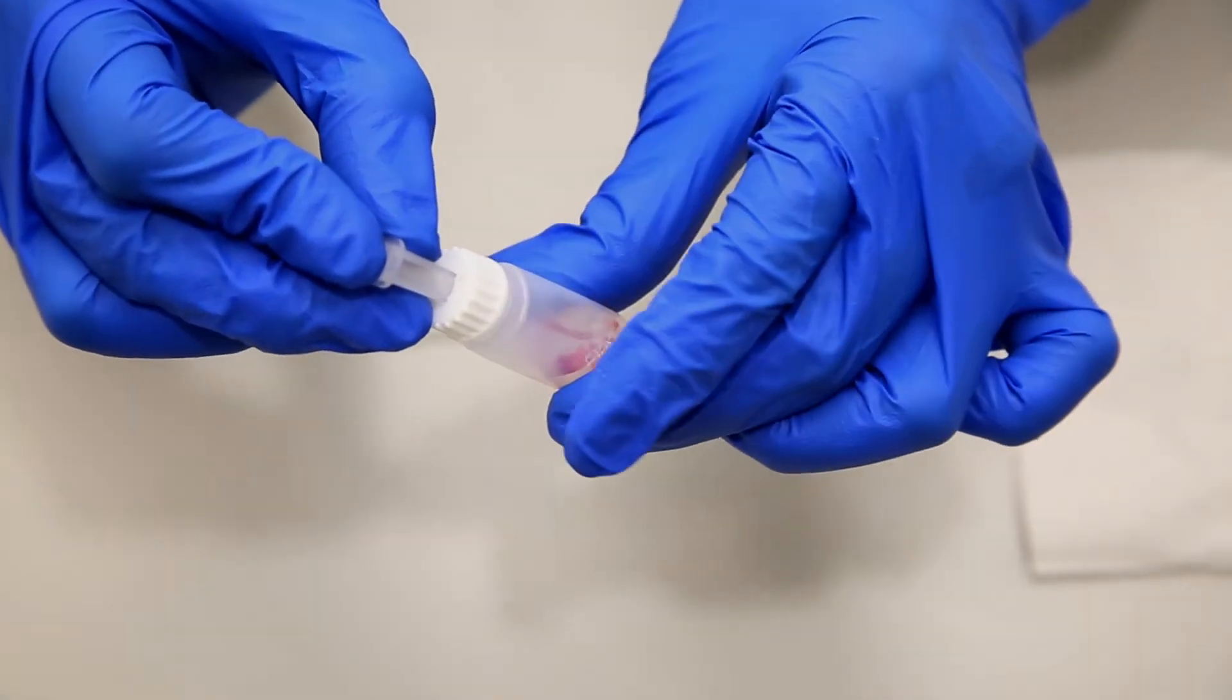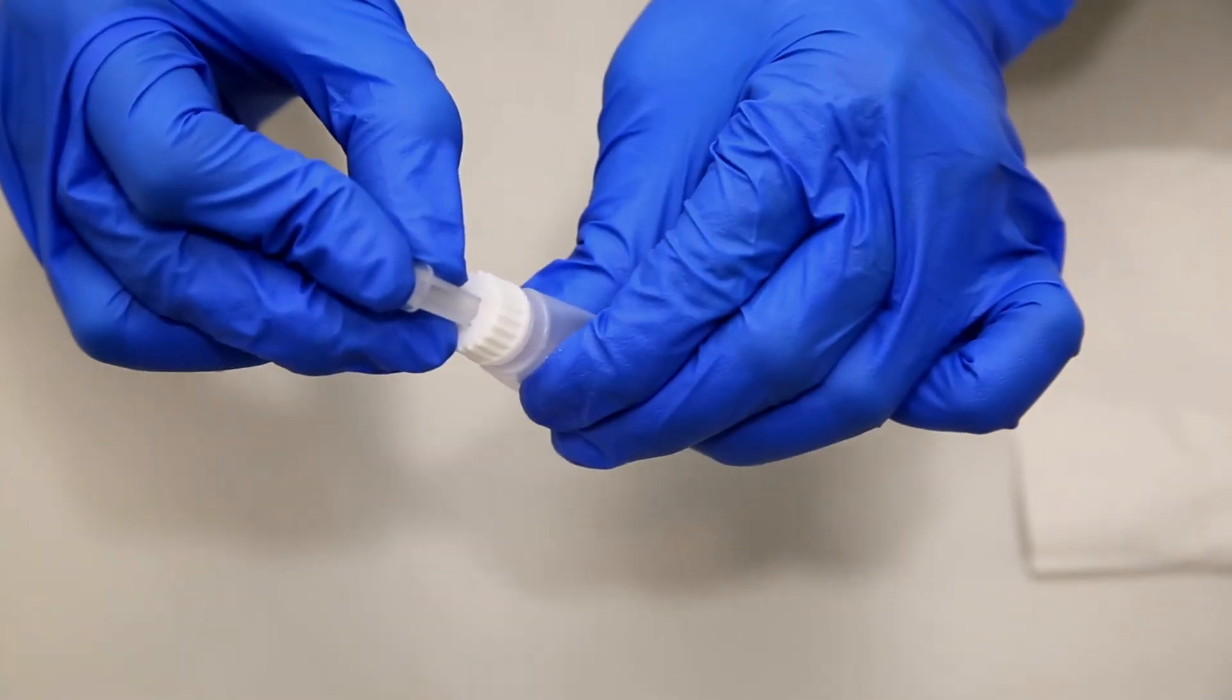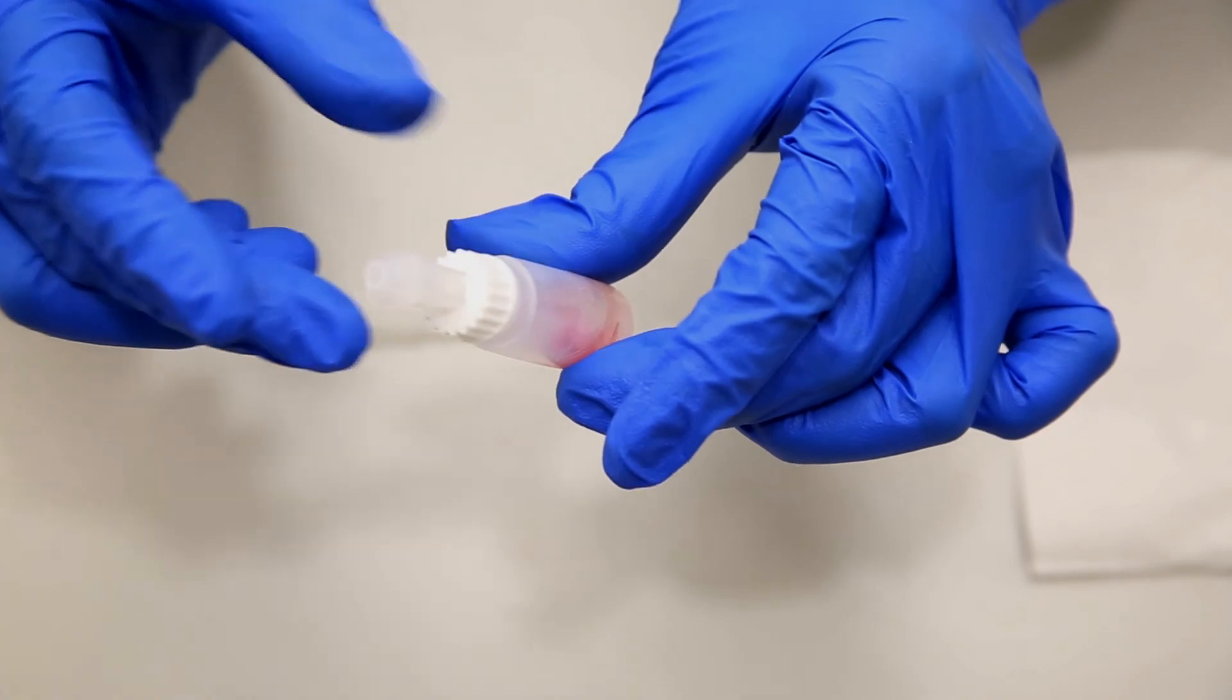Release the pressure on the reservoir and remove your finger from the overflow chamber simultaneously. Negative pressure will draw the blood from the pipet into the diluent reservoir.